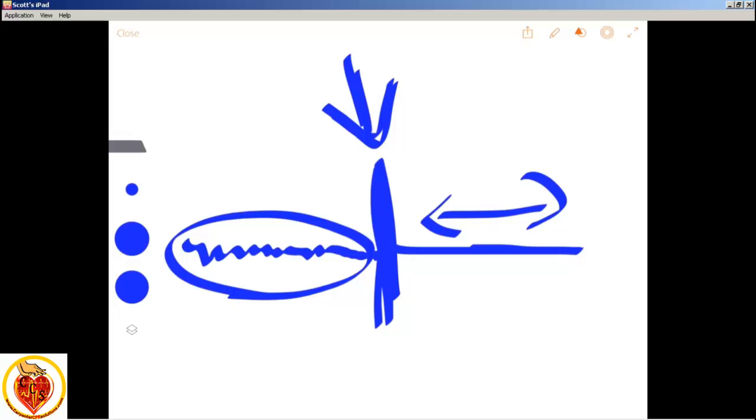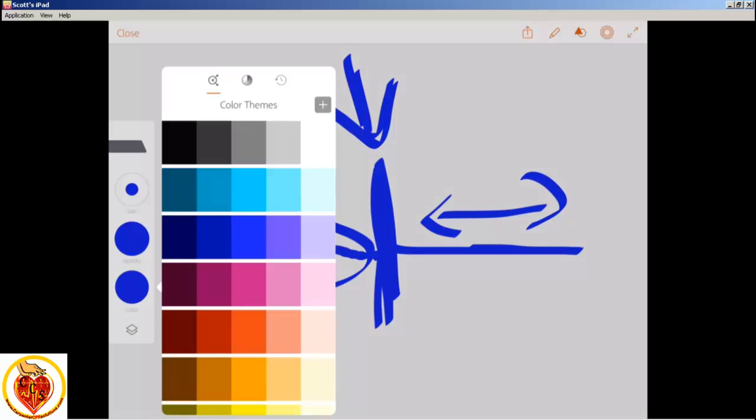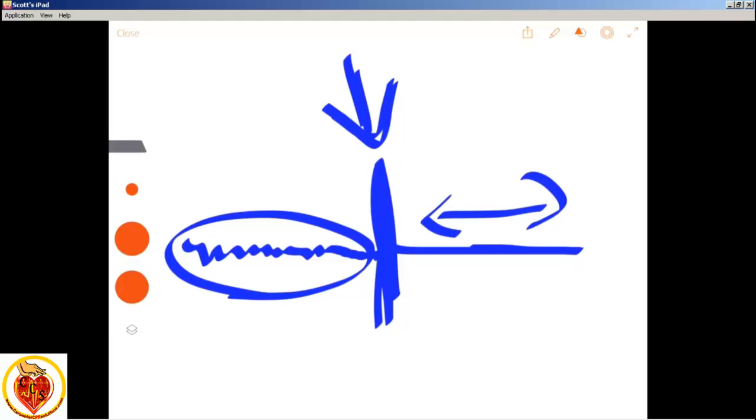It does not restart your heart. It simply shuts off ventricular fibrillation. It defibrillates it, if you will. You're hoping, because cardiac cells have automaticity and they turn themselves back on, you're hoping that after 3, maybe 5 seconds, you get some coordinated activity that starts from the top, goes to the bottom, lub dub again. And if that were the case, you'd save the patient's life.